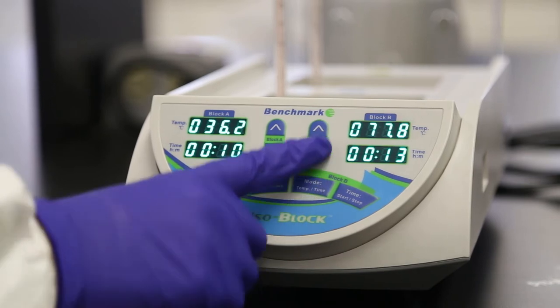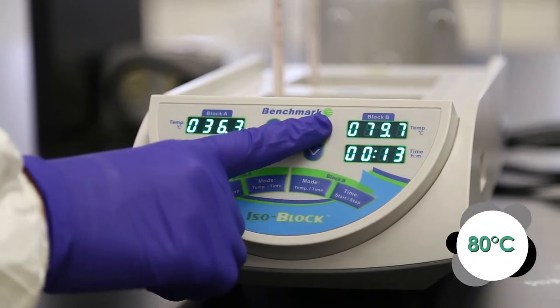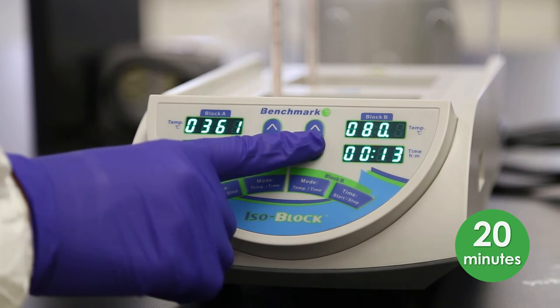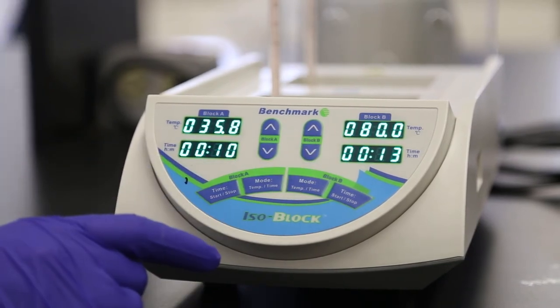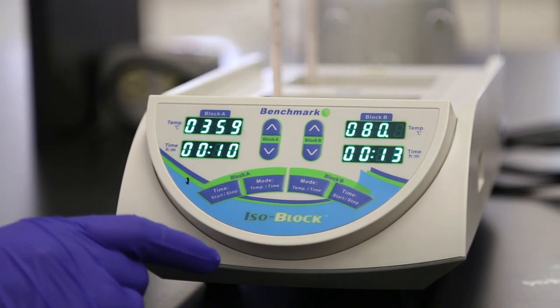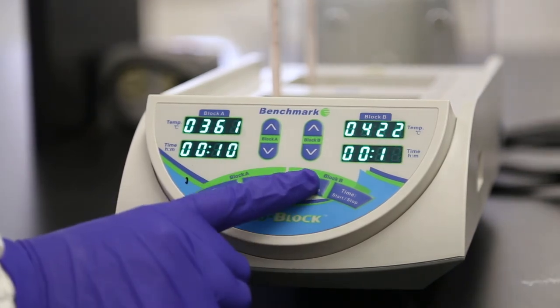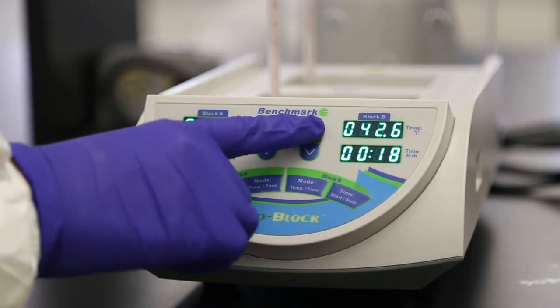Next, set the temperature for block B to 80 degrees Celsius and the timer for 20 minutes using the controls for block B following the same steps you used for block A. Again, the block will immediately start heating. Do not start this timer either.